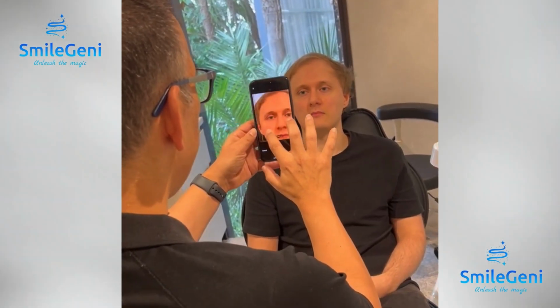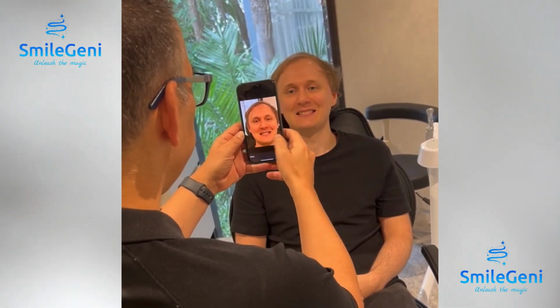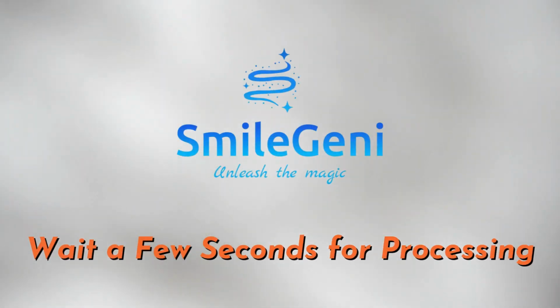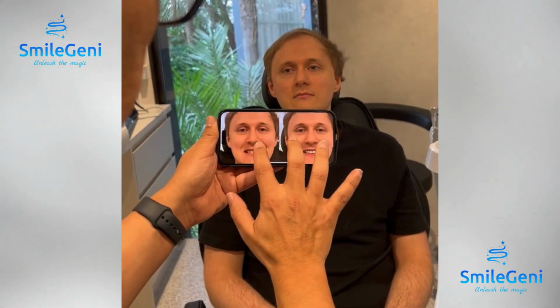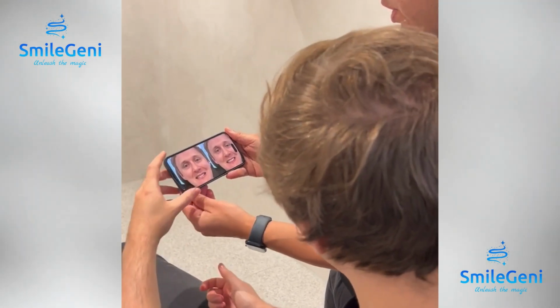Okay, Ryan, give me a big smile. So we're going to take the photo. And we're now going to upload it. So Ryan, that's your Smile Geni results.